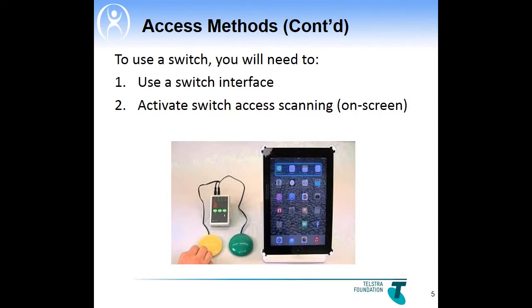At the ILC, we have two Bluetooth switch interfaces, the applicator and the switch to scan. Any of the switch interfaces which connect via Bluetooth will reduce the tablet's battery life and also may lose the Bluetooth connection intermittently. Some people find this to be a problem, but others don't. Always check how the switch interface will connect to your device.